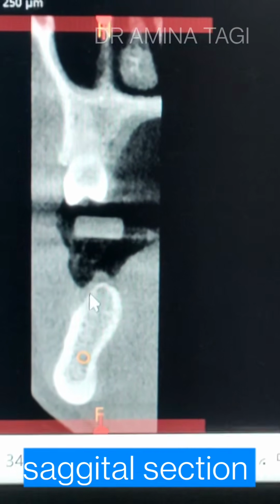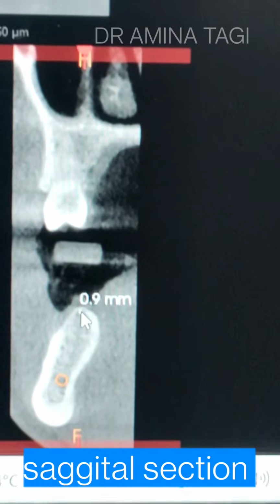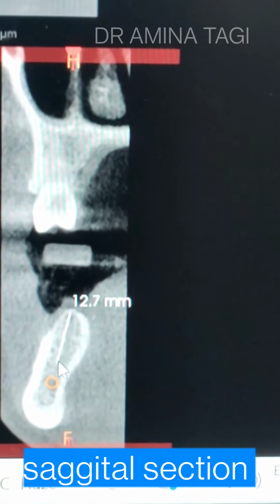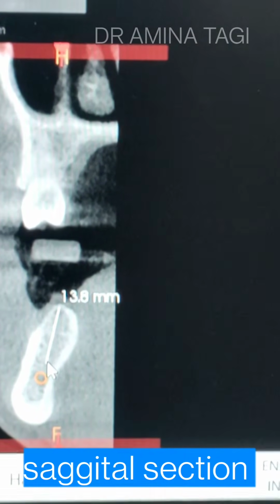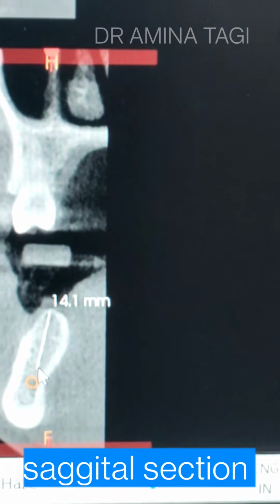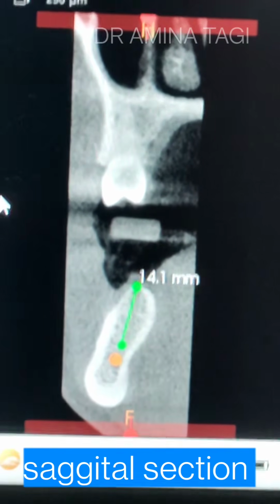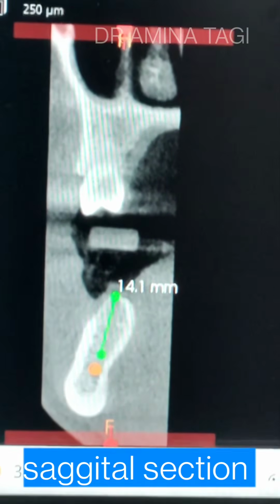So if you're confused about what this orange line that was presented before is, this is the neurovascular structures. So whenever you are taking the implant length, your neurovascular structure should always have a distance of 2 mm between the neurovascular structures and the implant. So I have taken this implant as 14 mm.